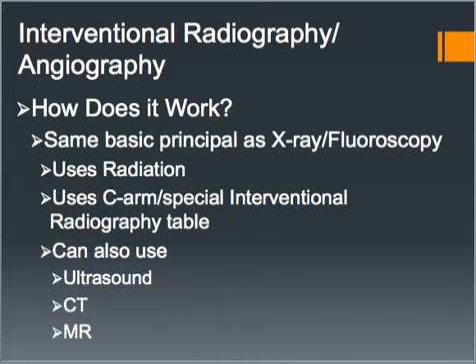The fluoroscopy used during angio, sometimes I use angio as short for angiography too, allows the doctor to watch live as they advance the guide wire through the arteries, or to watch the contrast flow to see if there's any blockage or an aneurysm or something like that. So they're using that live imaging just like fluoroscopy to visualize their work as they go.